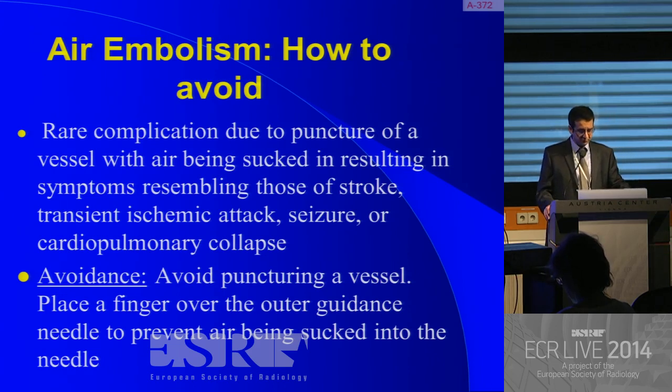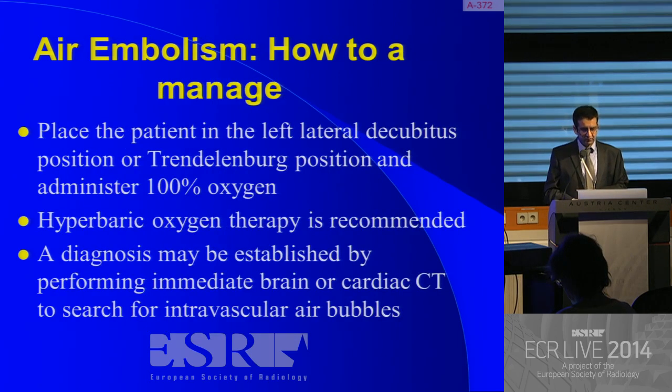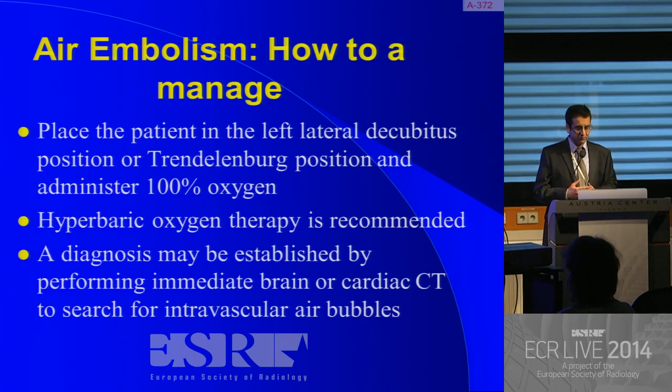How we can avoid this is by avoiding puncturing a vessel in the first place, placing a finger over the outer guidance needle to prevent air being sucked in, putting your coaxial stylet back in straight away as you're taking the biopsy specimen out. If an air embolism does occur and the patient does become symptomatic, consider placing the patient immediately into a left lateral decubitus position or the Trendelenburg position, administer 100% oxygen. These maneuvers help to place the air within the right heart and prevent it going into the left side. In severe cases, hyperbaric oxygen therapy may be recommended, and a diagnosis can be established by CT.